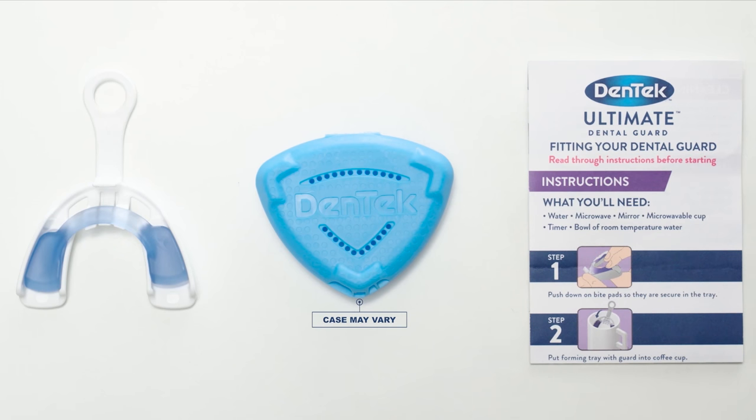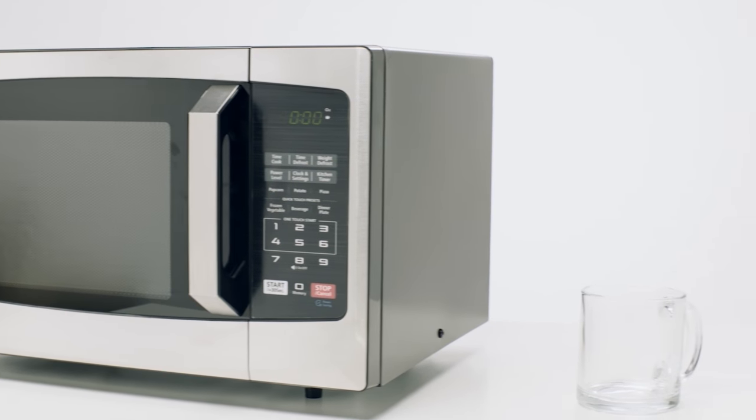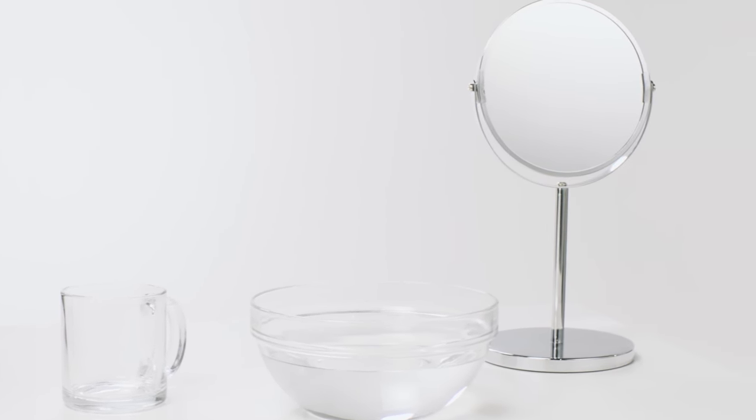First, read all the instructions and warnings and watch the full video before you begin to fit your Ultimate Guard. You'll need a microwave, a microwavable cup, a bowl of room temperature water, a mirror, a digital timer, and a fork.